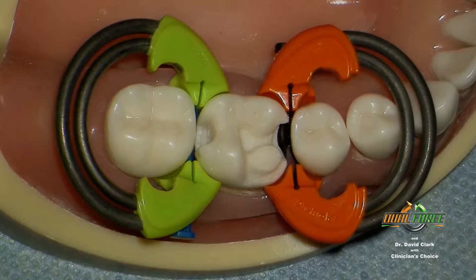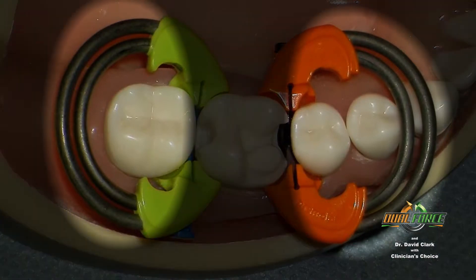So let's start with the new dual-force separators. My goal, together with Clinician's Choice, was to create proper engineering to do five things well and take matrix systems and resulting restorations to a whole new level. Number one, the nitinol springs in the dual-force separator are designed to avoid breakage and fatigue. We accomplish that with dual nitinol springs that distribute forces evenly over the body of the springs. They don't break and they don't wear out.